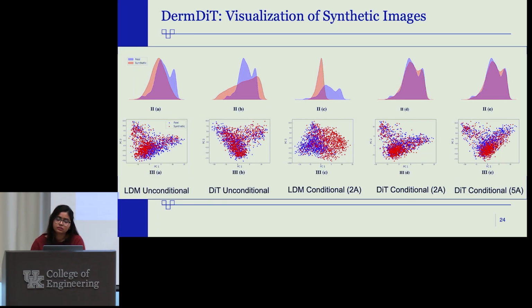Yeah, but I don't think that those data sets represent most of the possible cases. You don't have darker skins showing in your data set. Most of the cases seem to be a very specific group. Yeah. These are the type of dermoscopic images. Each of the images has this skin image, including the part of the skin that was affected.